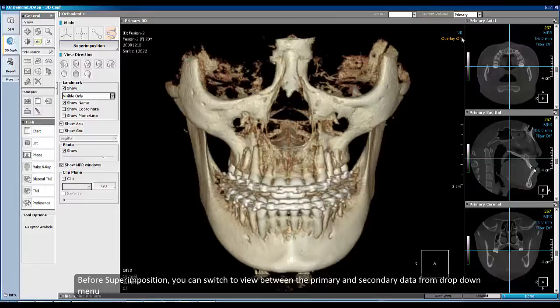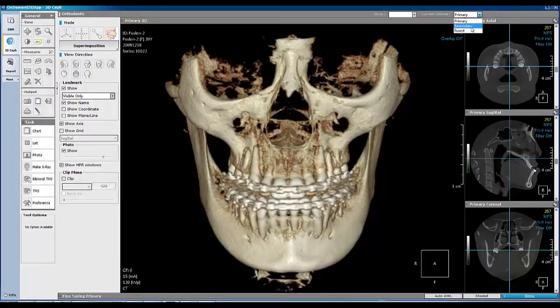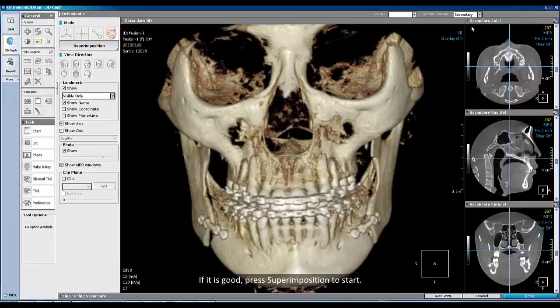Before superimposition, you can switch between the primary and secondary data from this drop-down menu. If it looks good, press Superimposition to start.